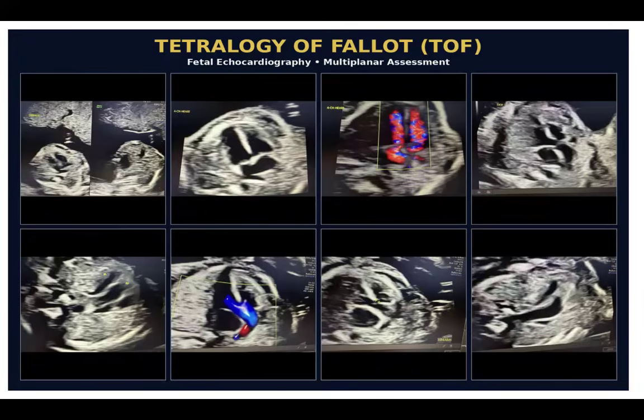There was no speculation of anything that could be possibly wrong with this heart at the situs level. Like I had no clue. Even once I got to four chamber, things looked pretty normal, and I put my color. And so I was thinking, is this dropout? As you can see, which we know is common when you're at your apical level.